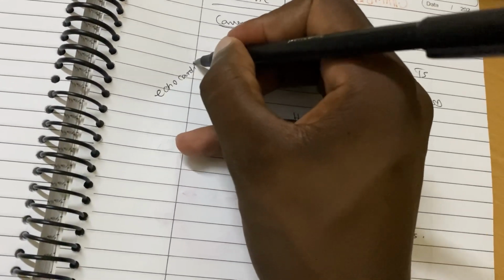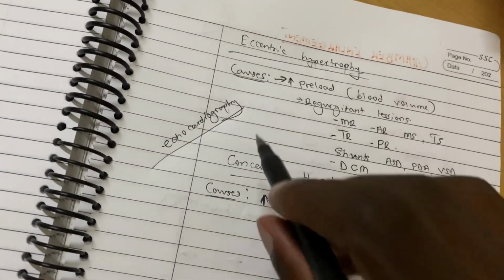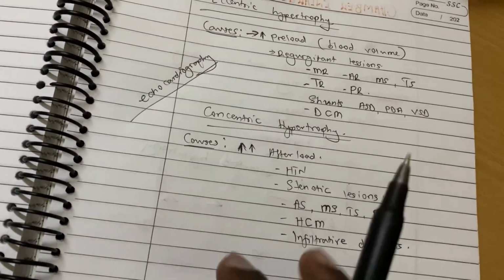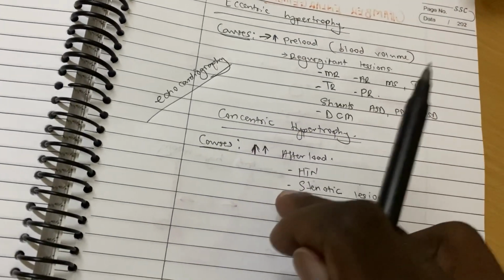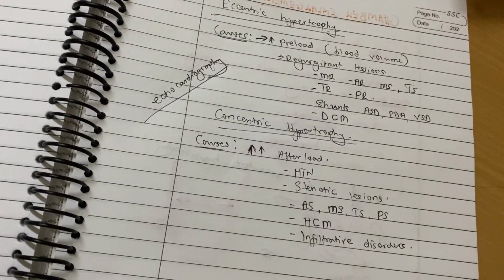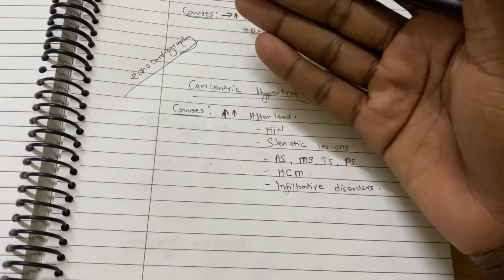Echocardiography we have to do. We can decide whether it is eccentric or concentric. Otherwise, here we may not. Why are we so interested in knowing whether there is eccentric or concentric hypertrophy? Because if we decide to go for a higher level examination like echocardiography, we have to see and correlate with ECG findings.